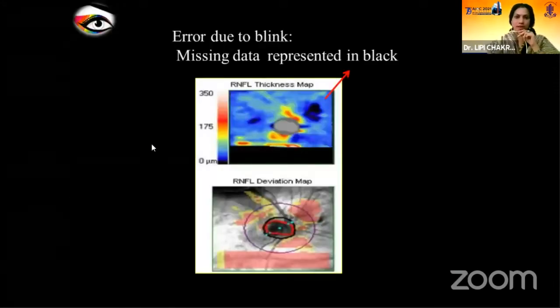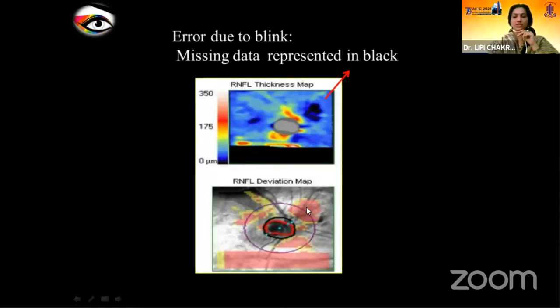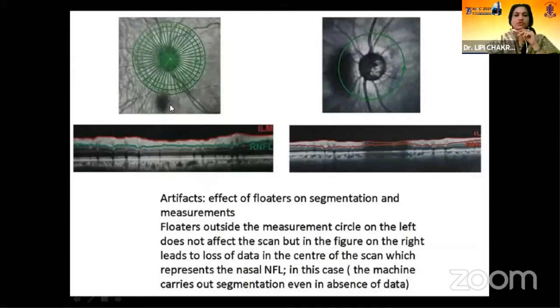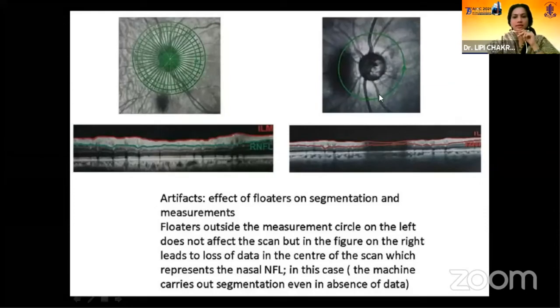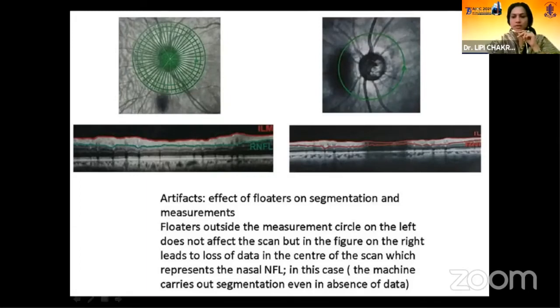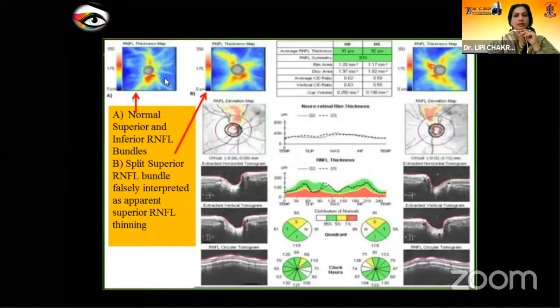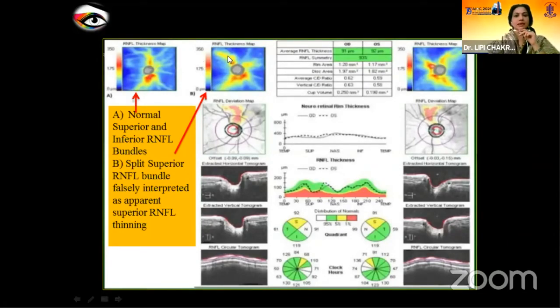Regarding the effect of blink — missing data represented in black suddenly causes red in the deviation map. Artifacts from floaters — in the case of a PVD not within the measuring circle, it doesn't affect the OCT. But when the PVD vitreous floater sits on the disc, it affects the center of the scan, causing loss of data representing the nasal NFL. We need to be careful in case of PVDs. Also, there is an entity like physiologically split RNFL bundles, which may be interpreted as apparent RNFL thinning.